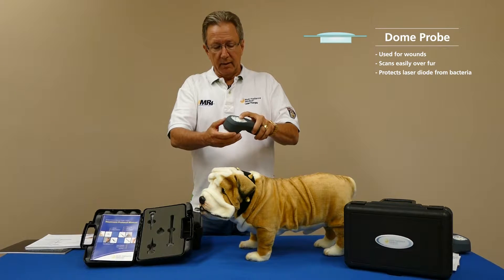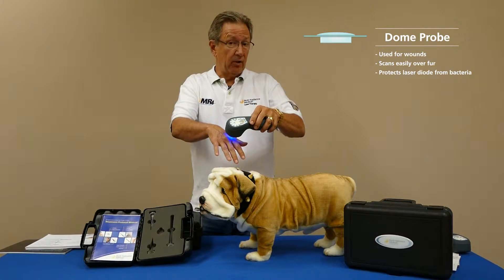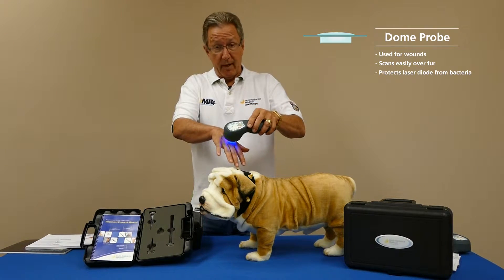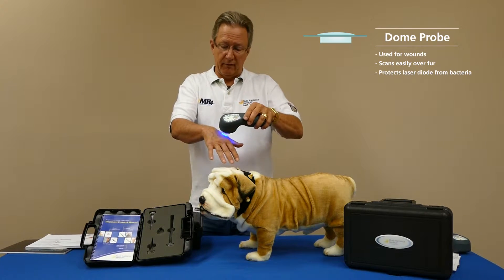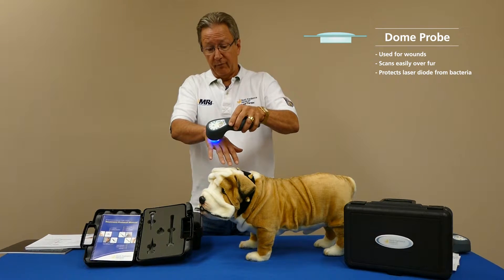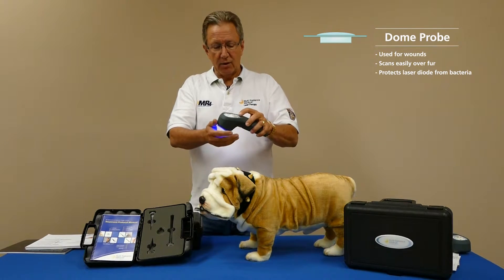Also kick in that blue light anytime you have a break in the skin. With horses it may be a fungal issue; with dogs and cats, anytime you have a break in the skin you want to prevent or mitigate infection and fight it faster — kick in that blue 470 nanometers, a wonderful wavelength for that. Just hover over the surface — that's the dome probe.